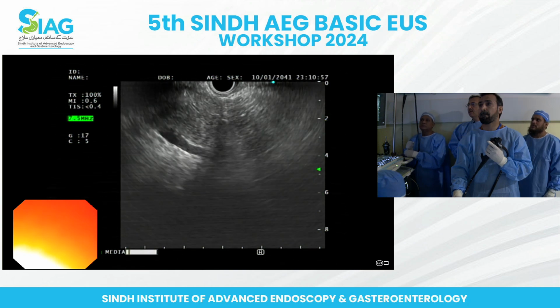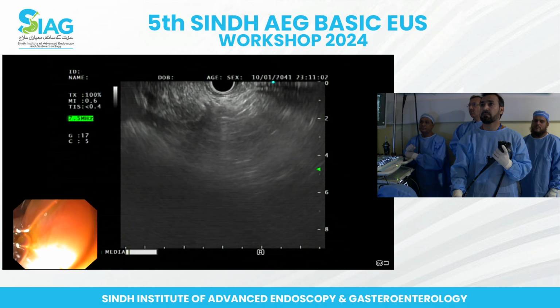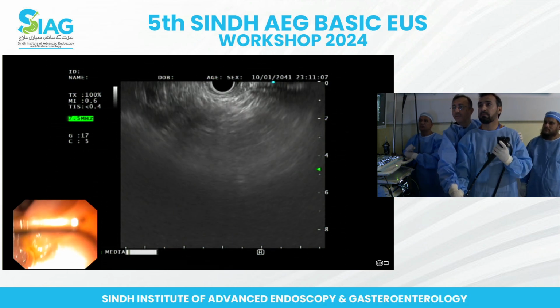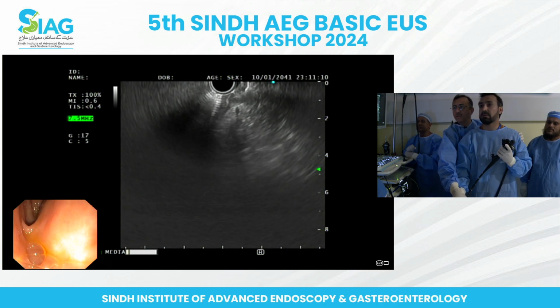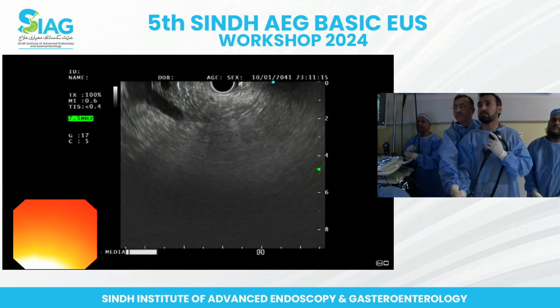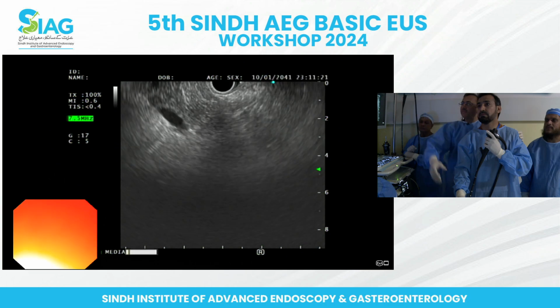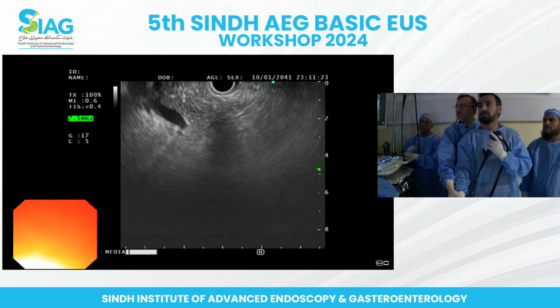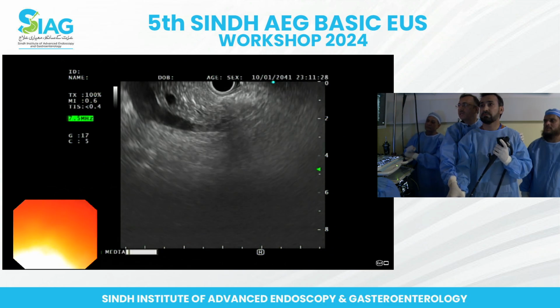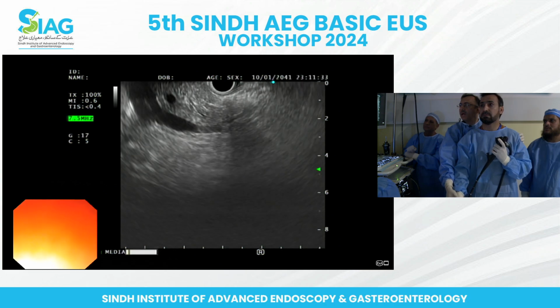Okay, fine. Try to bring that portal vein underneath your transducer. Okay, good. Now you see, here is mesenteric. Not there. Look, you have seen it, so don't let it move; you have to evaluate it well. Big wheel slightly away from you, slight rotation to the right, slight rotation to the left. Now you see you're getting a better view. Yeah, again a better view.